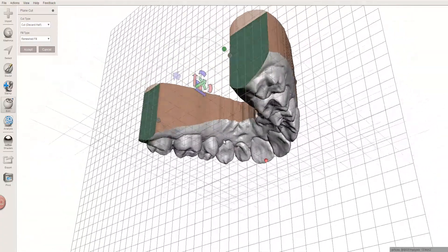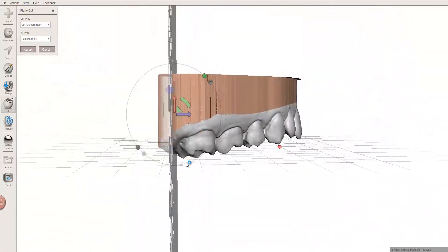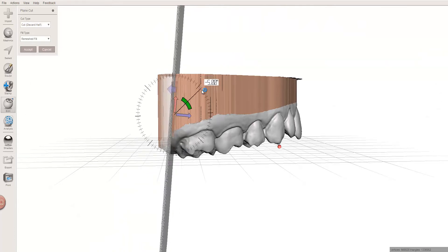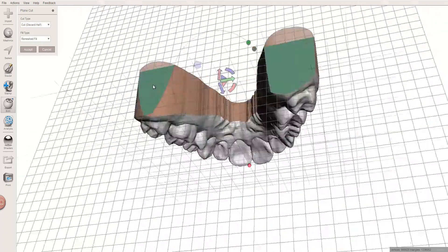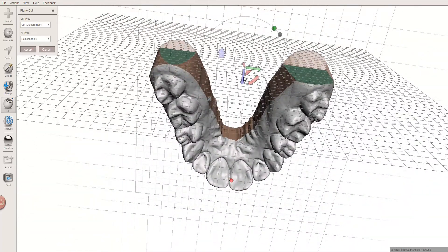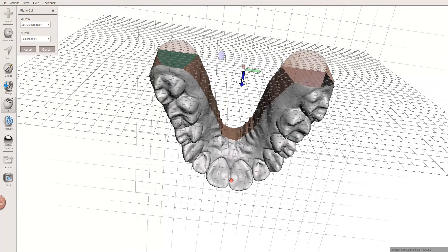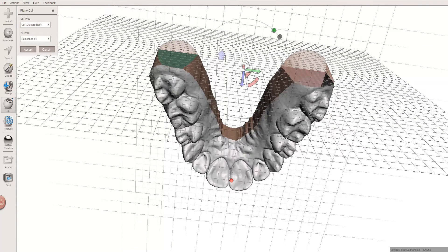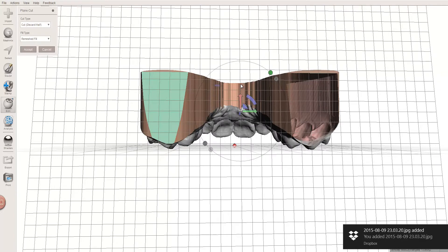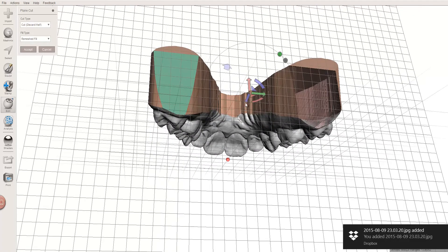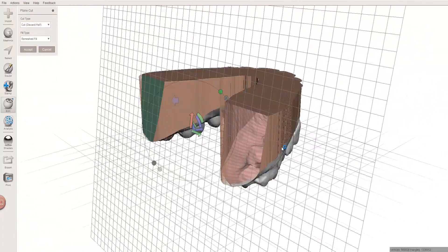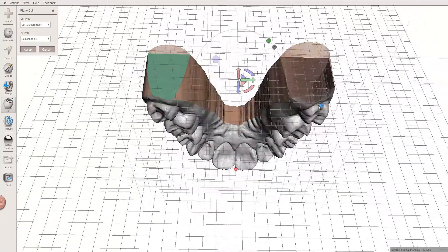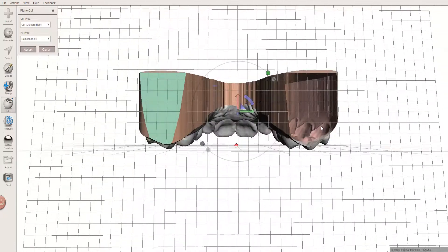However, sometimes I'll advocate for actually putting an angle to the cut, a five or a ten degree from vertical cut. If you're missing teeth and you have lone standing pre-molars, or retrocline incisors, I might go to ten. But the problem is, it's pretty common to have issues with open meshes when we do these. And I would say it's actually quite common. And so you have to go back and forth until you find that magic spot that is not open. It's frustrating and it can be really tedious and it can just take time and really be obnoxious.